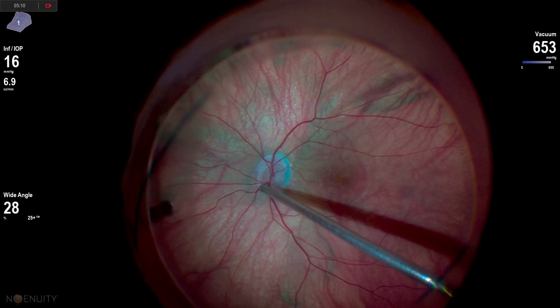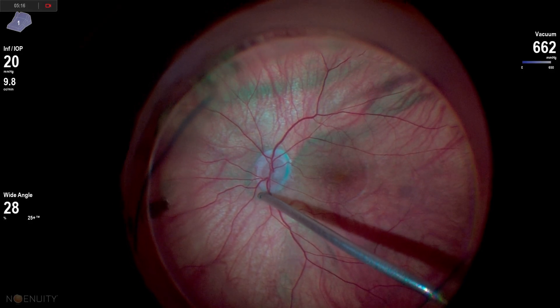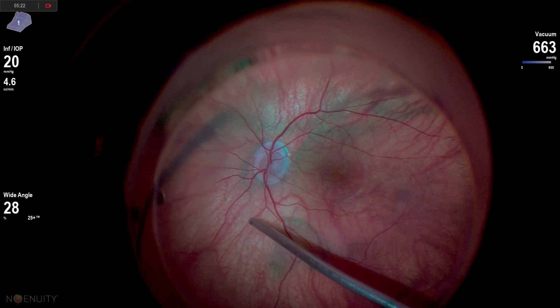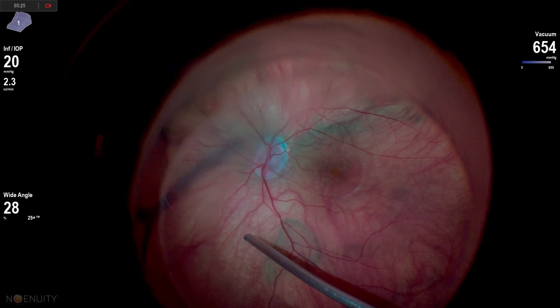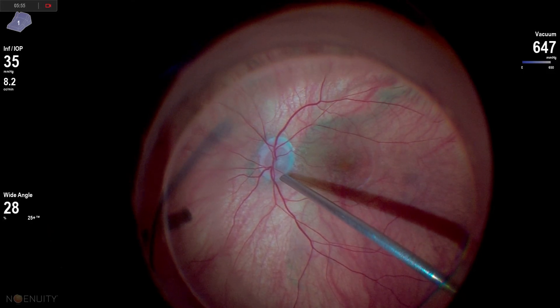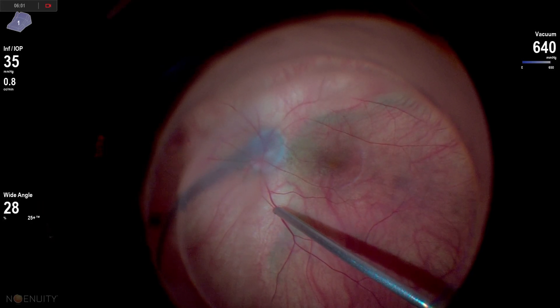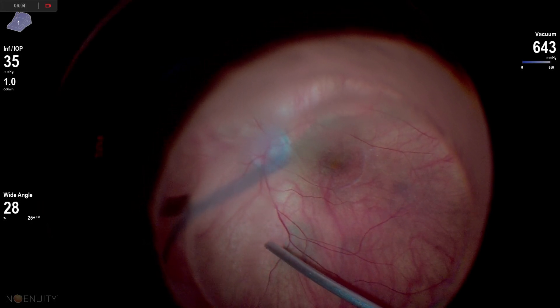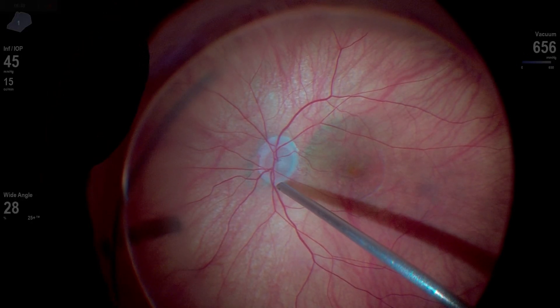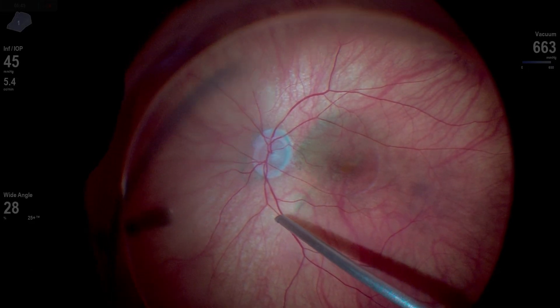Where I finally have success is here in a minute. I'm going to turn my cutter probe more posterior to further engage the vitreous — it's a little bit of a technically more difficult move to do, and I would caution people who don't have experience to actually do it. Here I turn my cutter port towards the vitreous starting over the optic nerve head, and that just allows me to better engage that vitreous to have better purchasing power with my 25-gauge cutter.